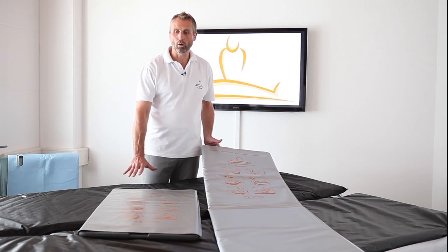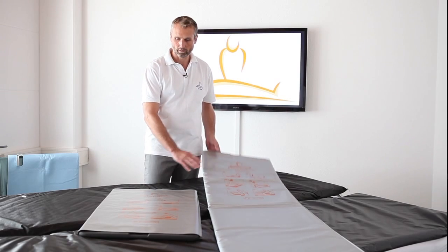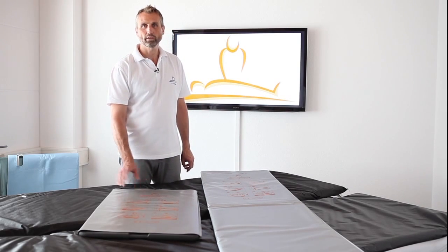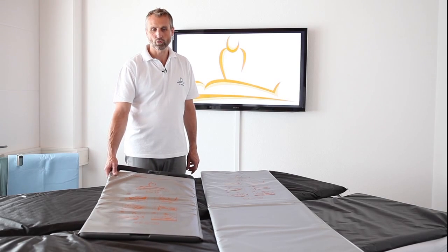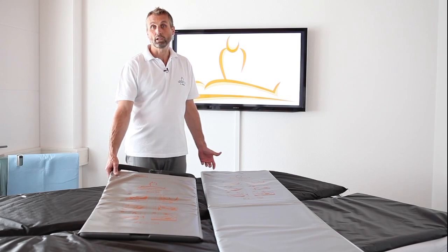These are our two sizes: that's the standard size and that's the mini size, mostly used in ambulances, emergency, rescue, and also for special needs in the operating theatre.